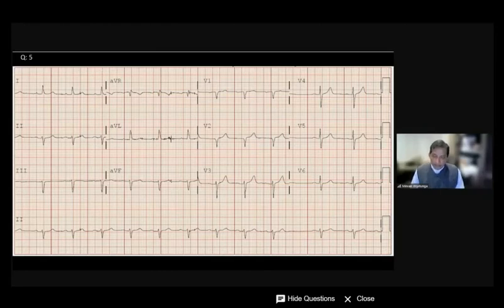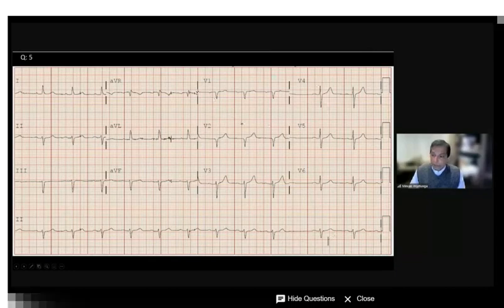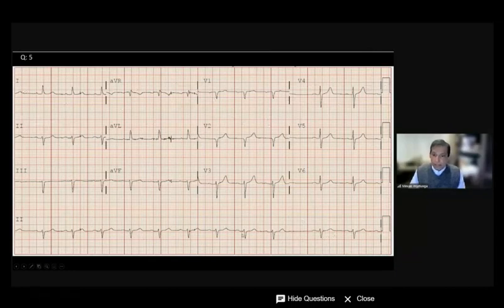Okay, it's not a sinus arrest. The correct answer is number 3. It's again similar to my previous discussion. That's why I'm highlighting. But you're getting better. Some of you are now noticing it. That's how we learn, and that's how I learn too. Again, when you see a pause, that's the first thing you notice. You see a pattern, sinus, it's a pause.